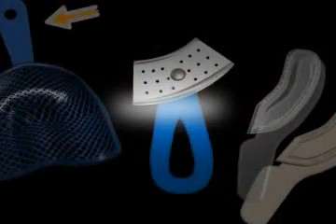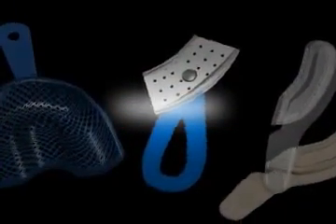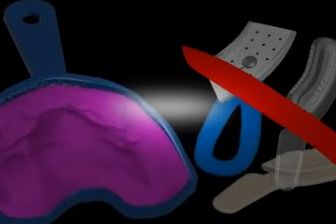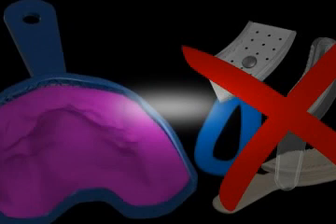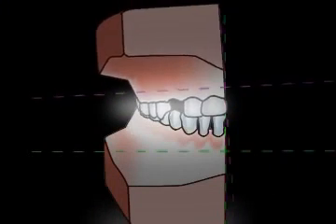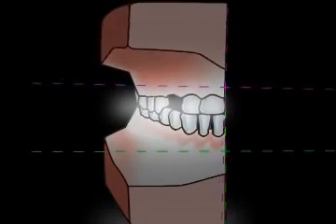Furthermore, impressions should always be taken with full trays, as seen on the left of the image. As a rule, partial trays, as seen on the right, are not exact because the position of the plaster models cannot be precisely aligned with one another. With a partial tray, the dental technician obtains partial models. These can be swiveled, and thus can't be positioned accurately.